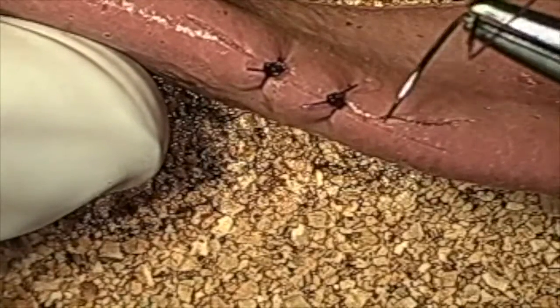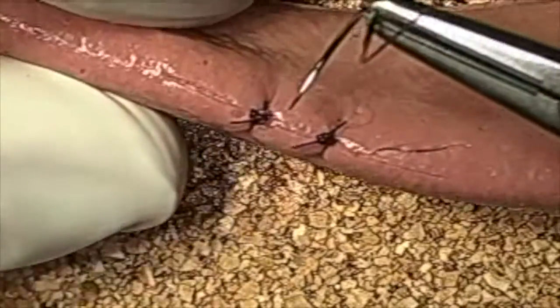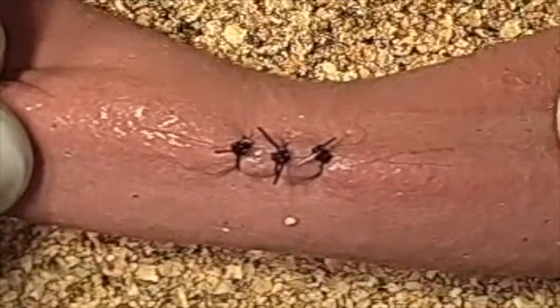Here we are finishing cutting. You can actually see that there's a bit of a gap between these two, so I would typically go ahead and probably begin putting the rest of my sutures in. That's where I would put one in between those sutures. They're about two to three millimeters apart. That's the particular size and distance I like to use for my bites. And notice here we have the finished product.